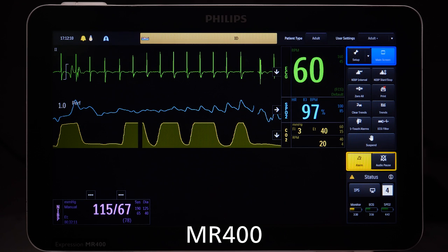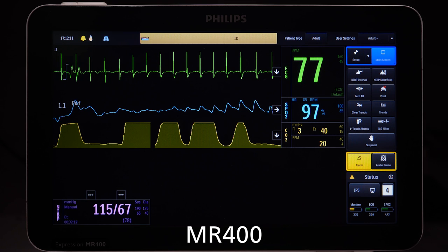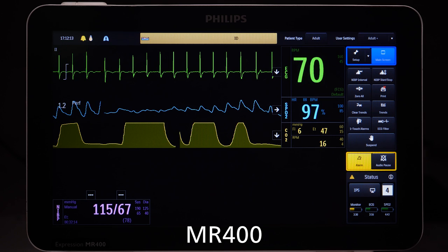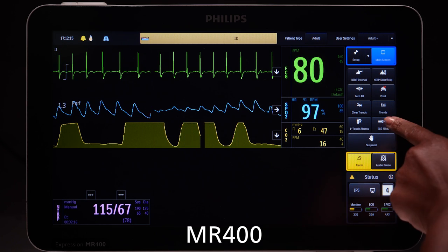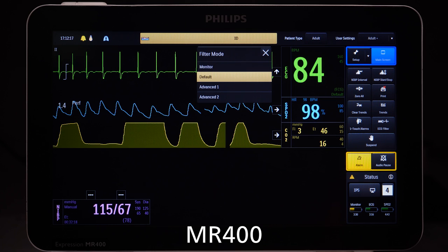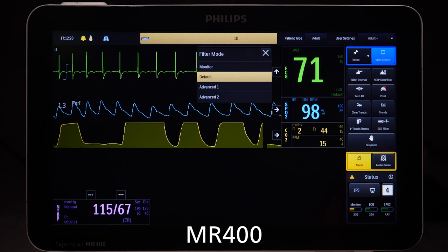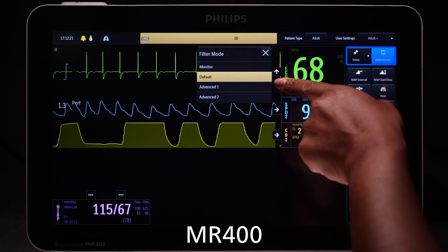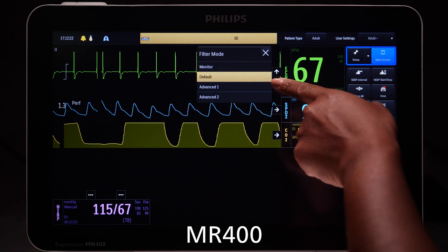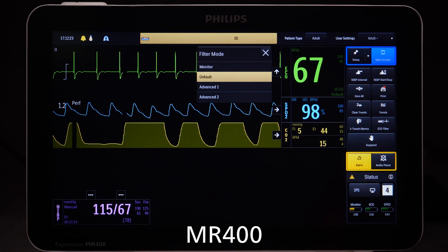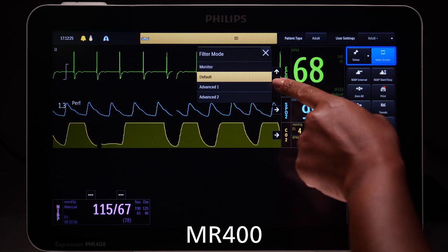When using direct wired and indirect wired ECG gating, it may be helpful to adjust the ECG filter mode to produce the best ECG signal. On the MR400, Advance 1 filter is the recommended filter for cardiac gating, followed by Advance 2 filter.